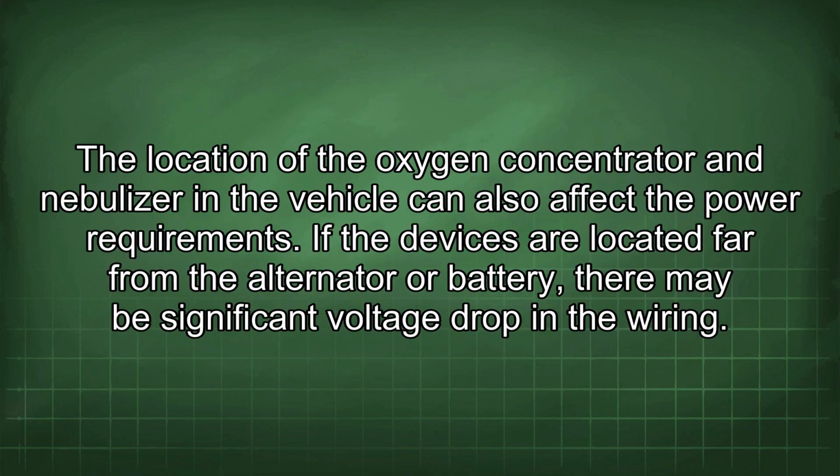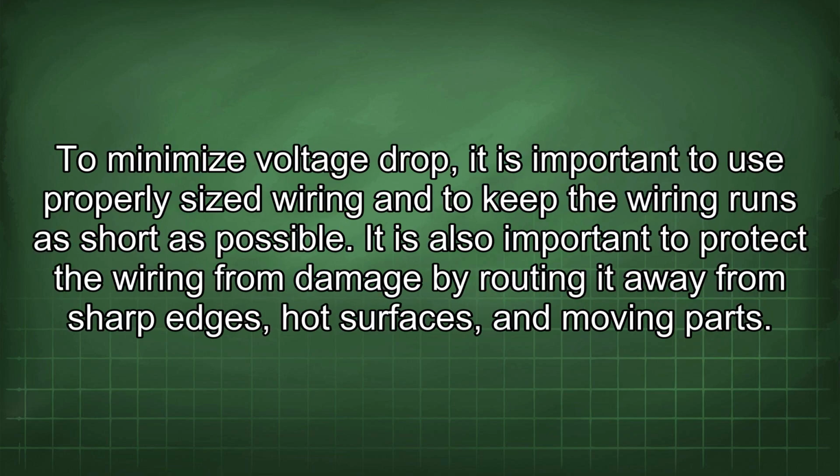The location of the oxygen concentrator and nebulizer in the vehicle can also affect the power requirements. If the devices are located far from the alternator or battery, there may be significant voltage drop in the wiring. To minimize voltage drop, it is important to use properly sized wiring and to keep the wiring runs as short as possible.